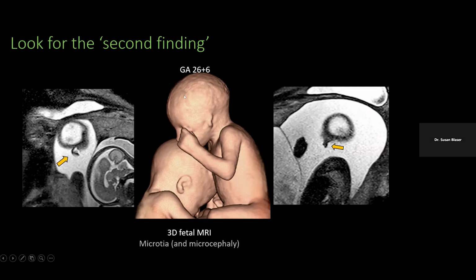So again, this is a 3D reconstruction done on the 1.5. And again, a bit of body habitus and signal to noise problems with this particular sequence, but the 3D was much easier to define. It helped to sort of unwrap all the limbs as well.